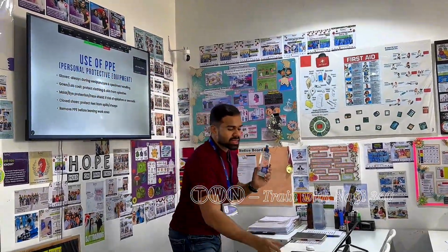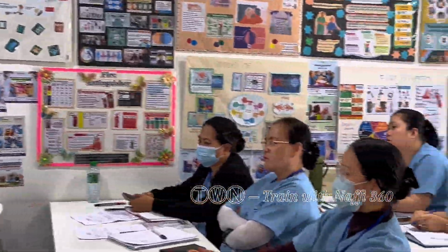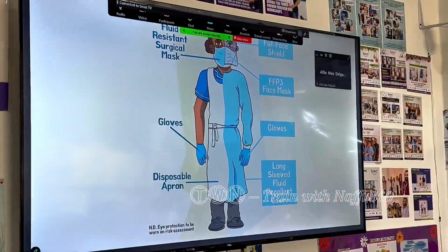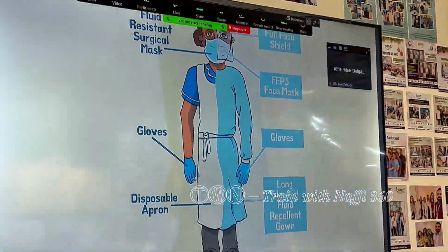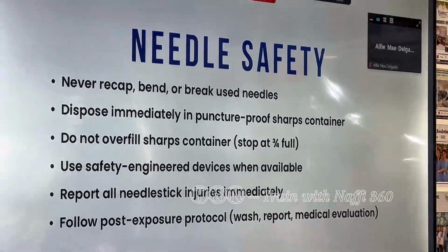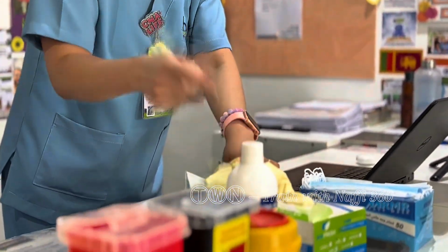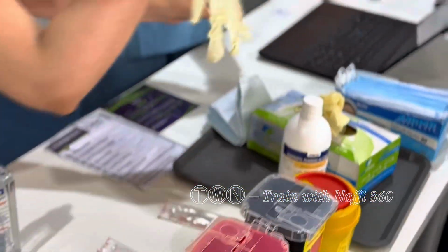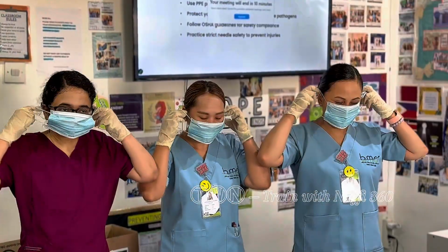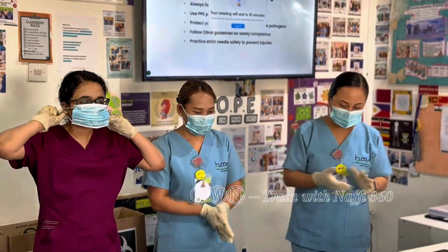During your practice, you also need to understand the modes of transmission, which is essential in order to prevent accidental exposure. So remember to take necessary prevention measures such as using PPE correctly, following hand hygiene and disposing of sharps or other waste properly in the designated bins. Once the concepts are explained to the students, they are also given an opportunity to apply their learning in hands-on demonstrations. They practice proper use of PPE, correct needle safety techniques, and step-by-step disposal of needles, needle caps, and barrels.